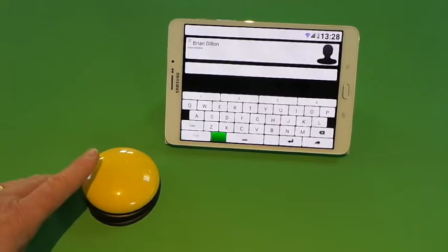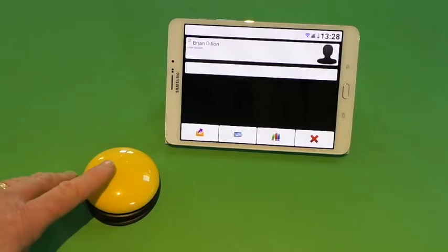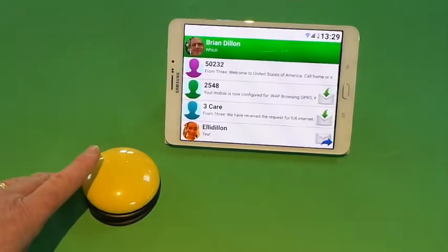All the graphics within the application, the colors and the layout and the fonts, are editable through the preferences so as to suit a user's visual acuity.